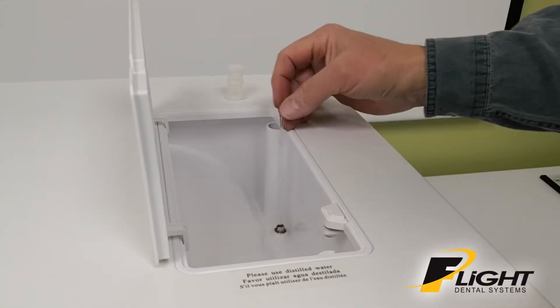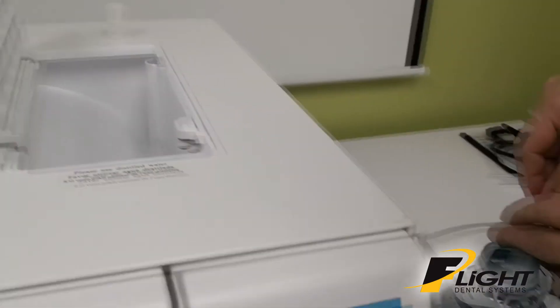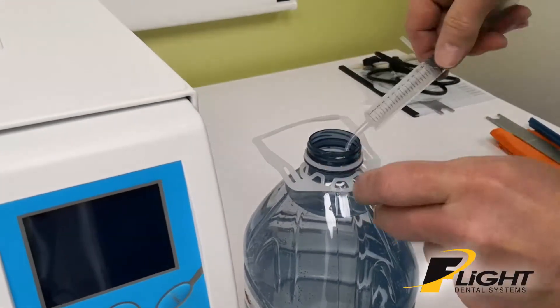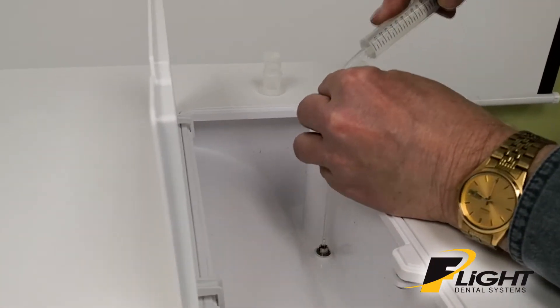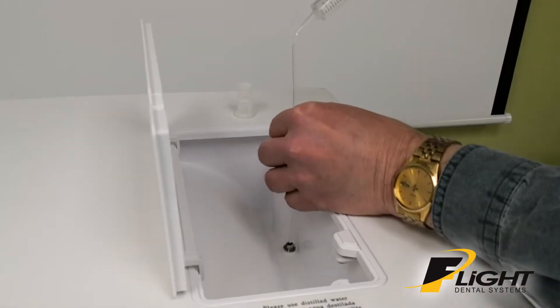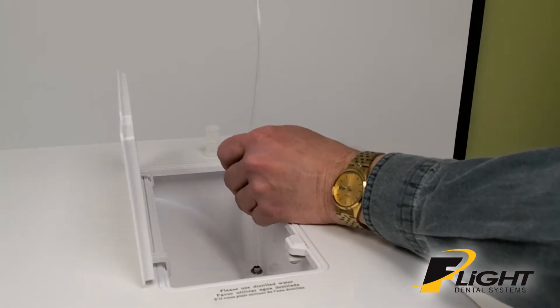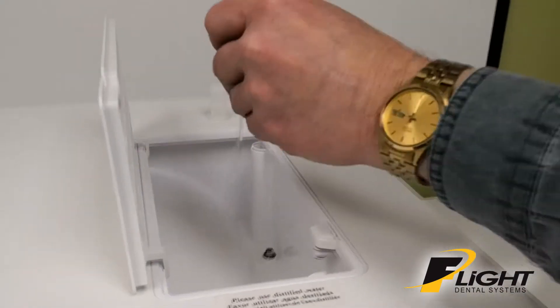You'll have about this much tube left out when it bottoms out. Take your curved syringe, this time fill it. Connect it to the tube, and slowly inject water into the tubing as you raise out your small tube. Now your pump is primed.